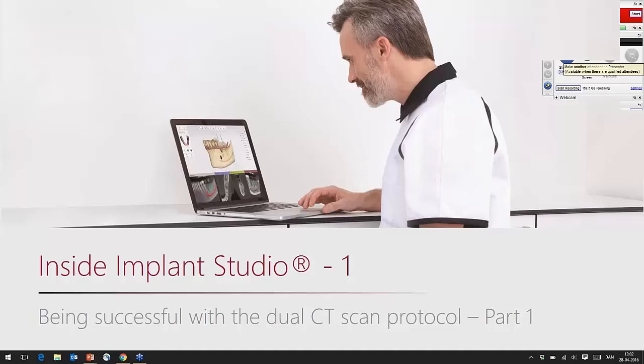So, as said, welcome to the first part of a new series of webinars we're going to run all around Implant Studio and what you should know or might need to know in order to be successful in your daily work.